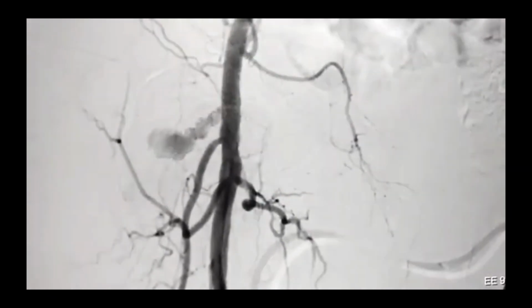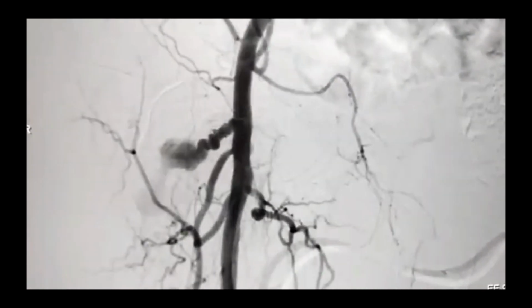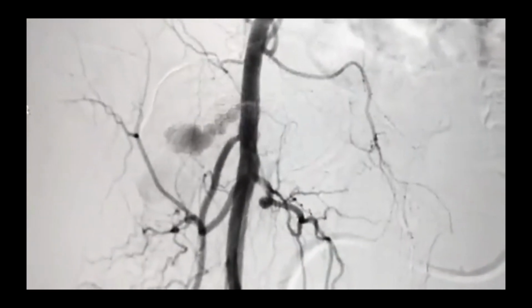This is regarding a middle-aged lady who had a CABG on IABP, and post-surgery they realized that there is a pseudoaneurysm on the right groin. There's a swelling of the right groin. Patient was referred to us for treatment of the pseudoaneurysm on the right groin. A Doppler was done and subsequently angiography was done.